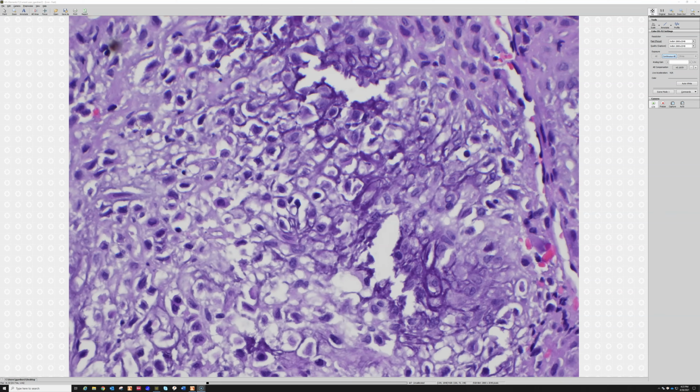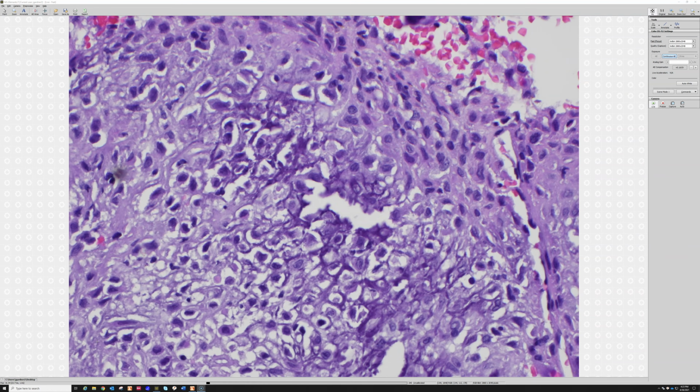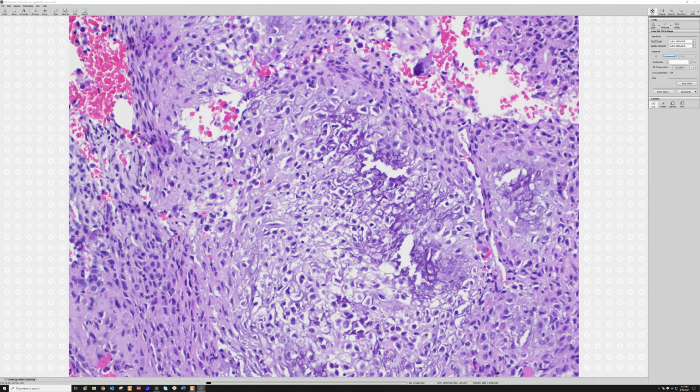Now, I have seen chondroblastomas that did not have good chicken wire calcification. So if it otherwise fits well, that's okay, I think. I've seen some that I thought otherwise fit well for chondroblastoma but didn't have this. But this is the characteristic feature that if you're lucky, you'll get to see.